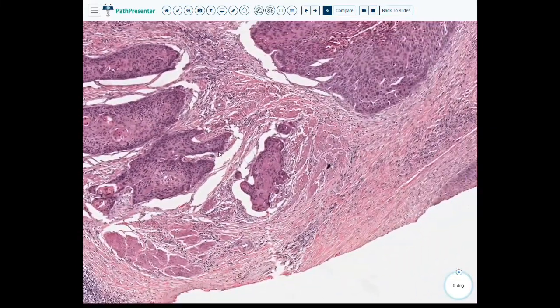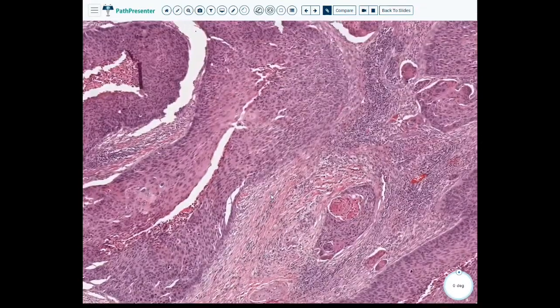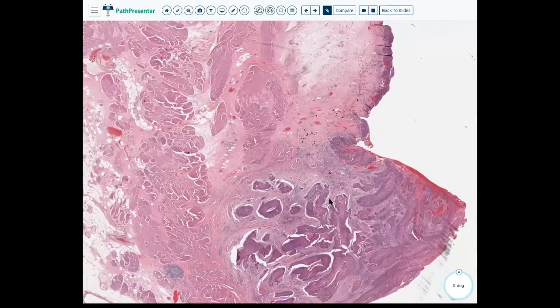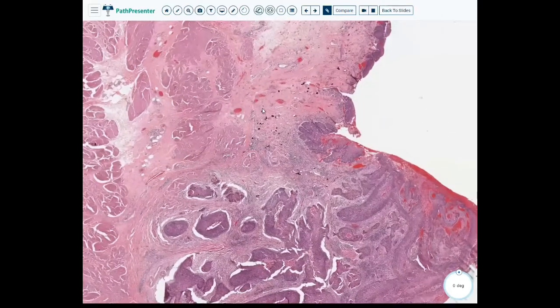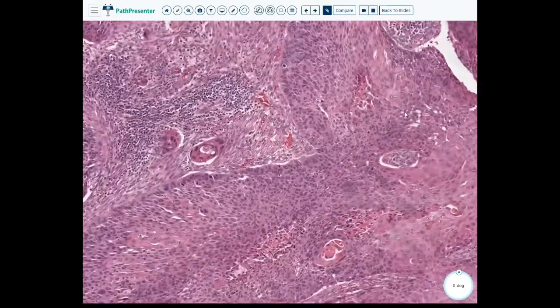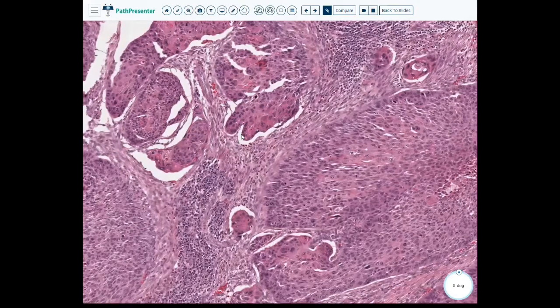So this case is a lot more interesting than at first it appears, because this is schistosomiasis haematobium with an associated invasive squamous cell carcinoma, which appears to be well differentiated. So again, here, so you can see it in that low power, here are your calcified eggs. Okay. Very interesting case. So case 3, schistosomiasis, squamous cell carcinoma.